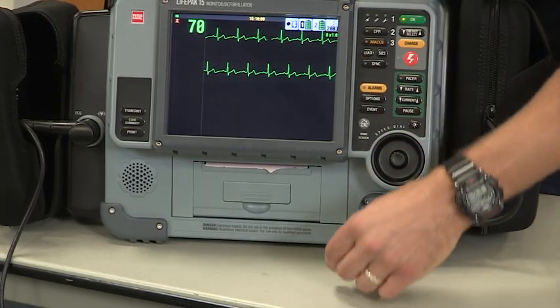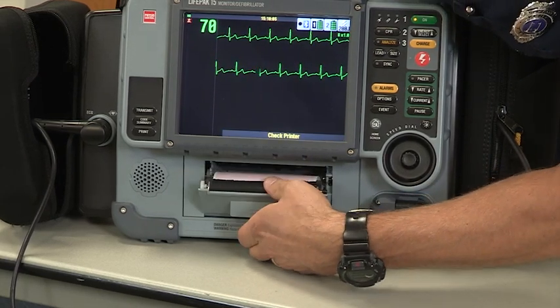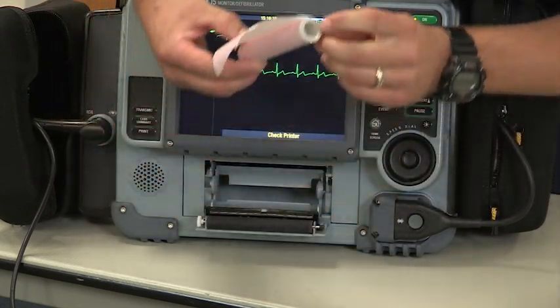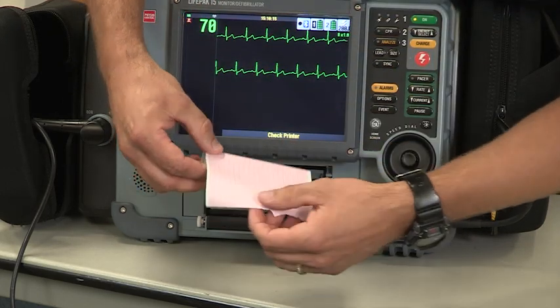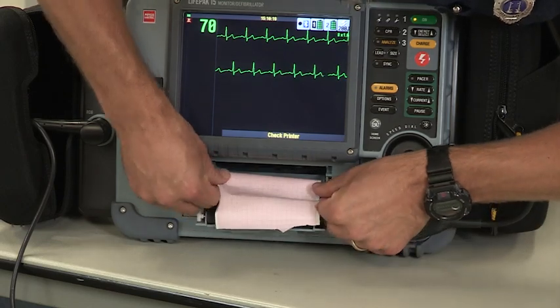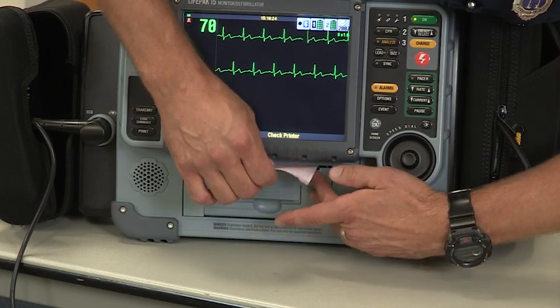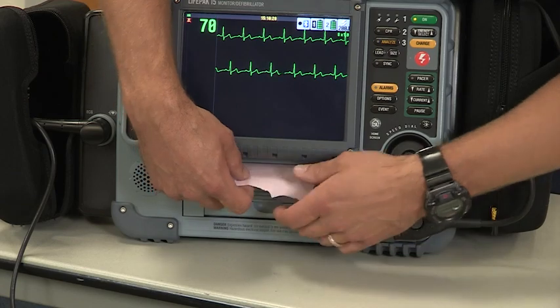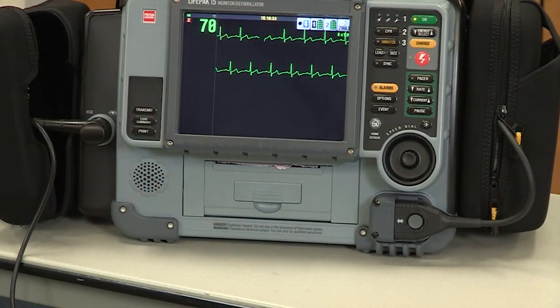If you happen to be running low on paper, the paper is located on the front. Simply pull up the tab, pull the door open, pull out the used plastic roll, grab a new roll of paper, and stick it in with the pink writing on top. Be sure that it comes out over the top of the roller, press the door closed, click the tab closed, and you're ready to print.